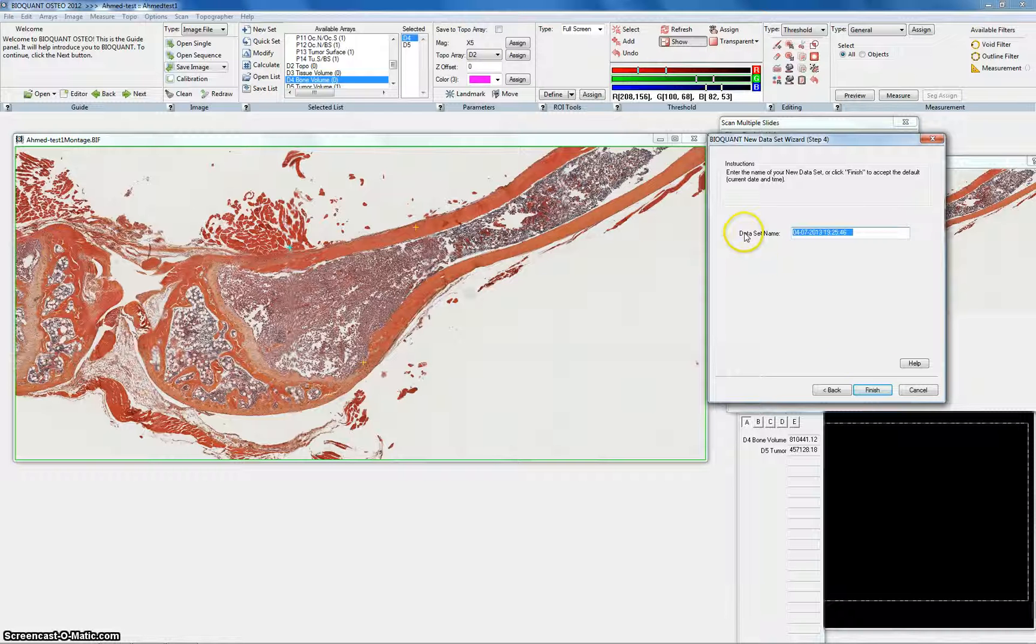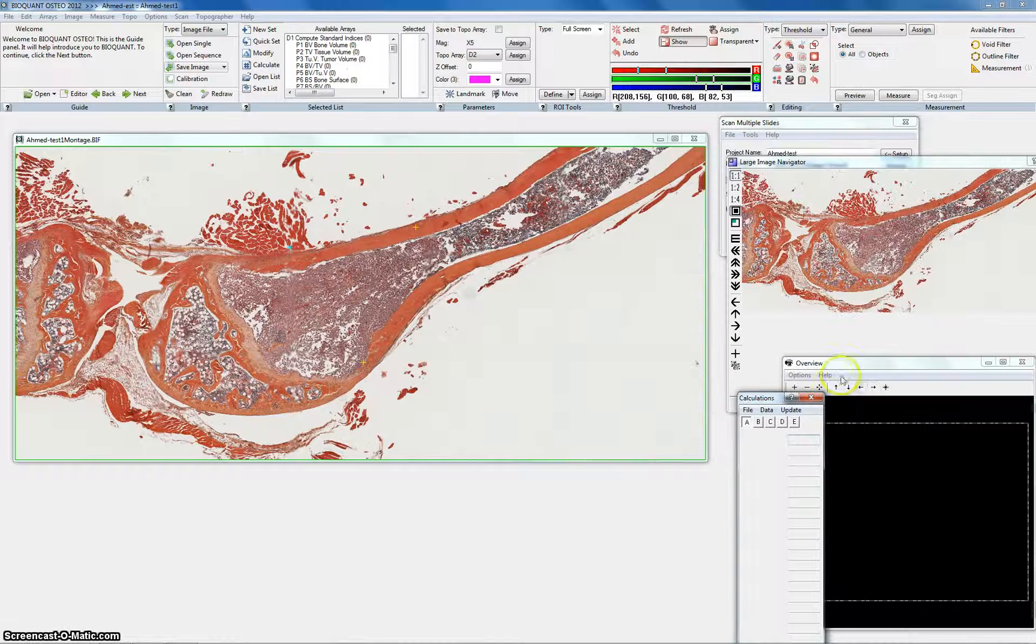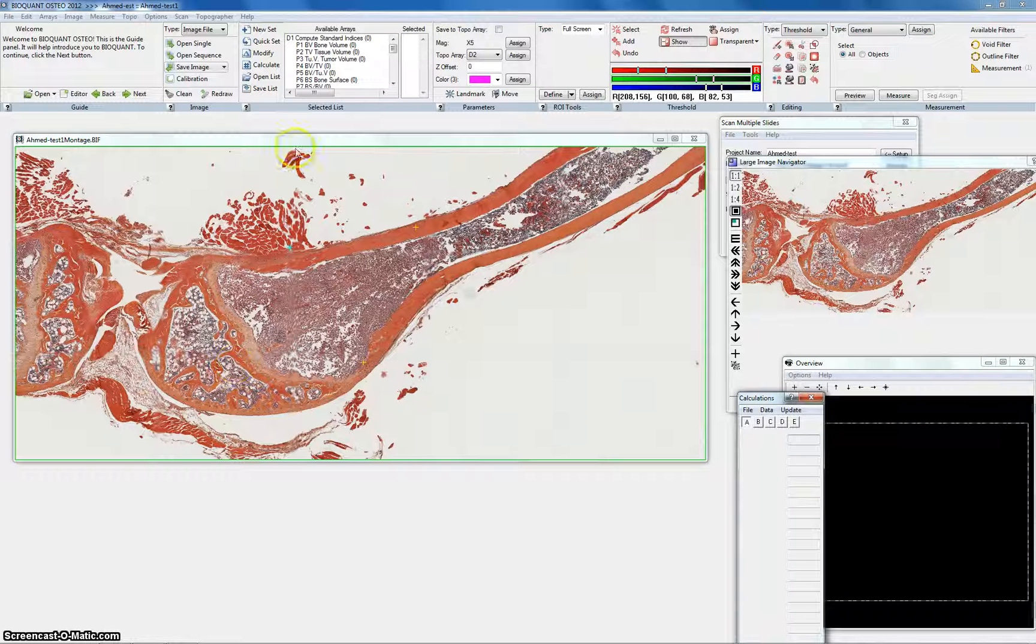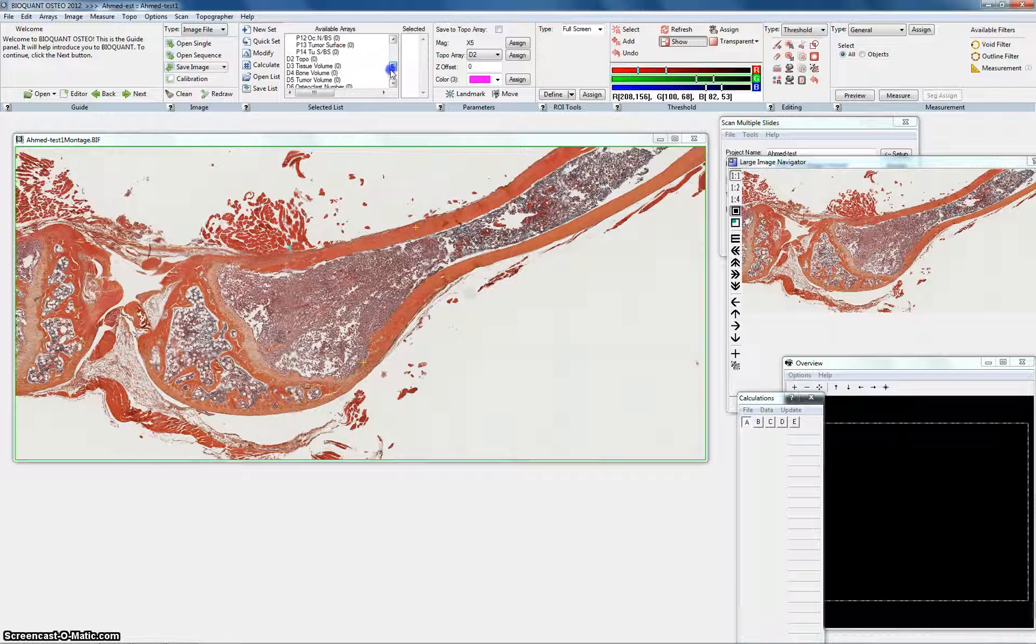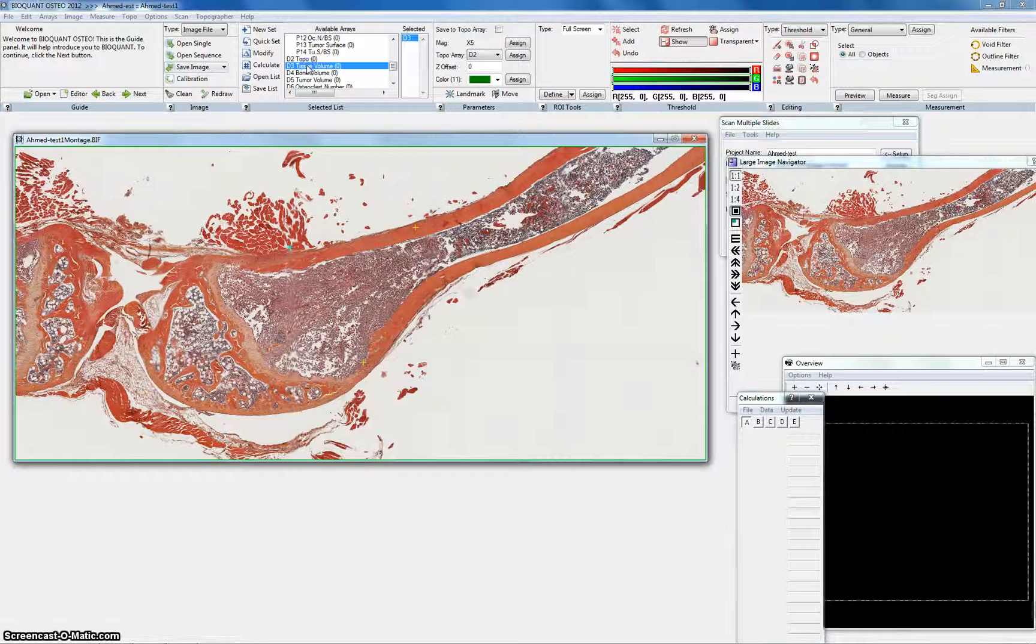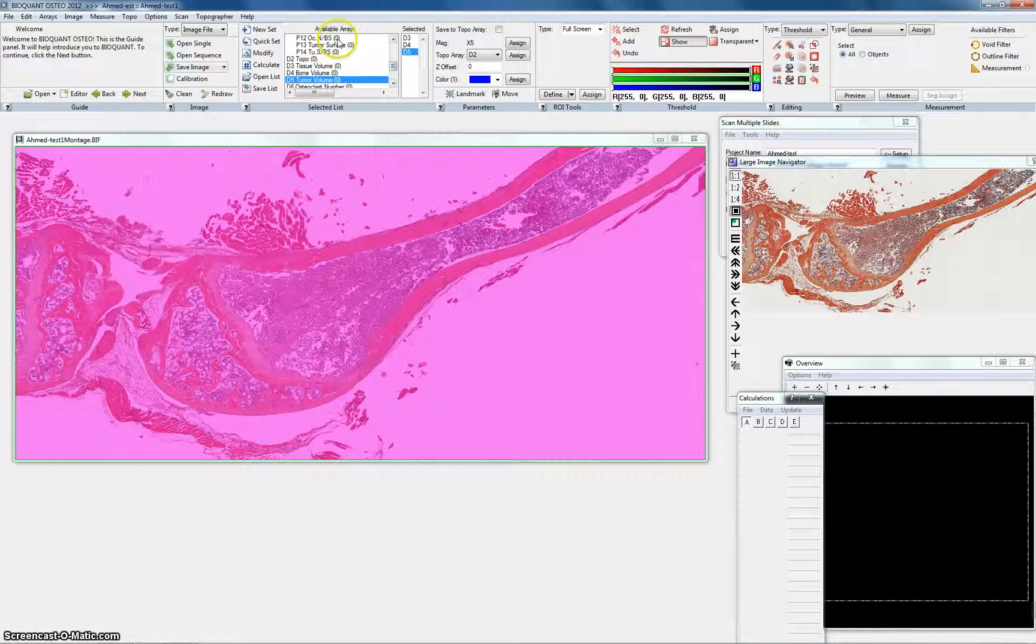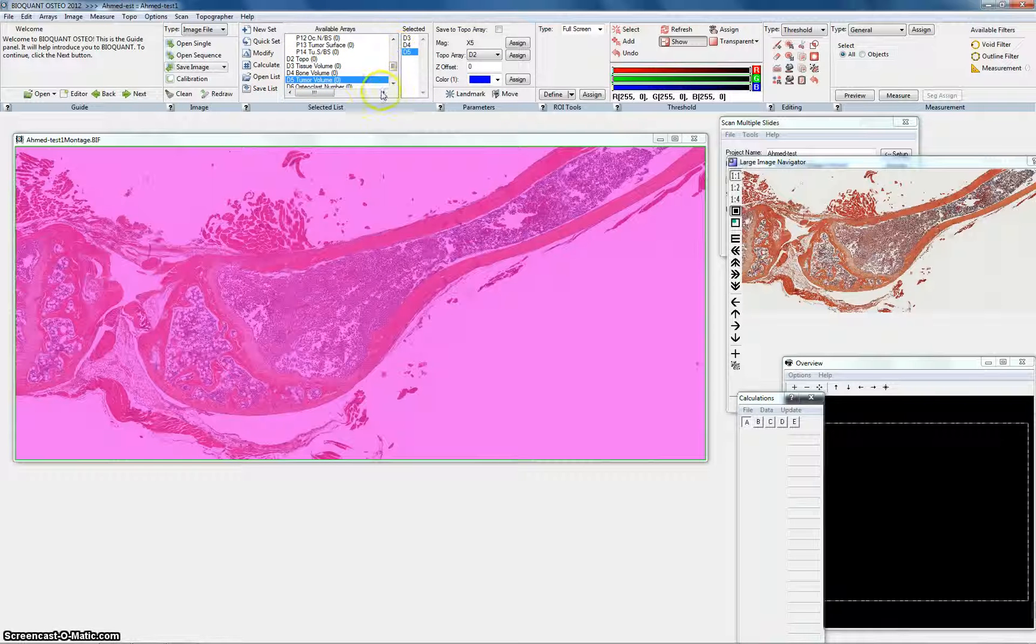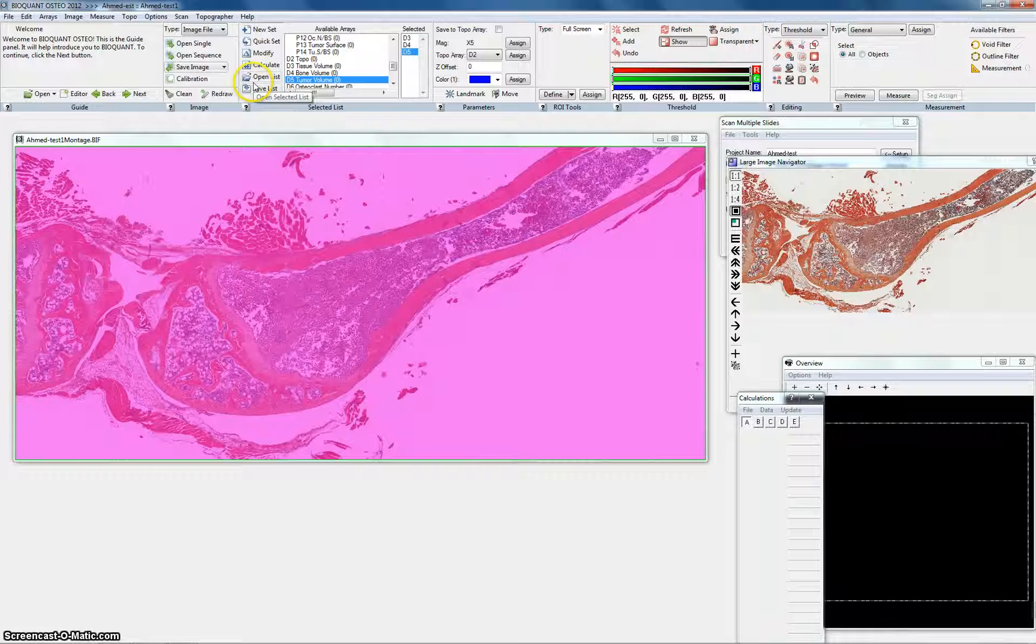This is the name of the individual project or the slide so this is Ahmed test one. And here is the items you want to measure in this slide. Let's say I want to measure the tissue volume, the bone volume, and the tumor volume.